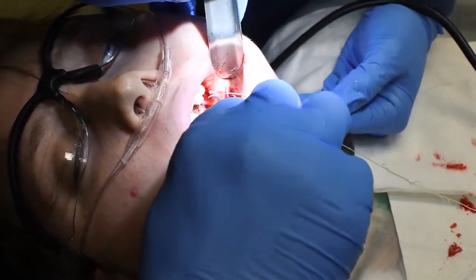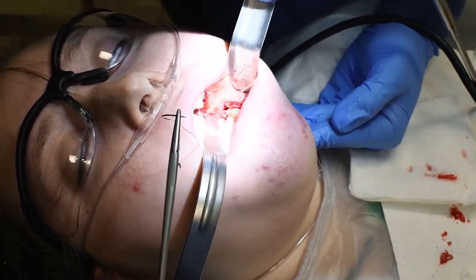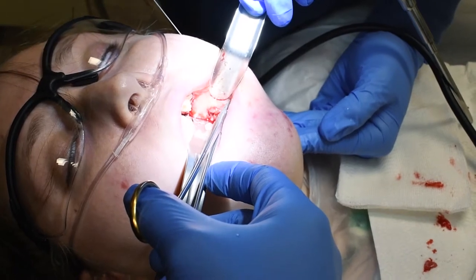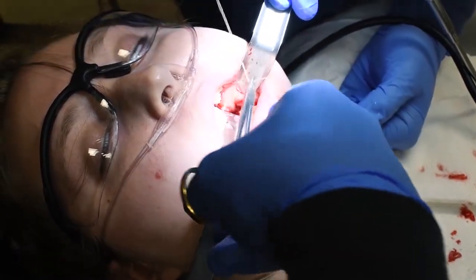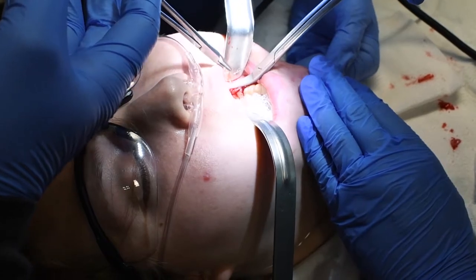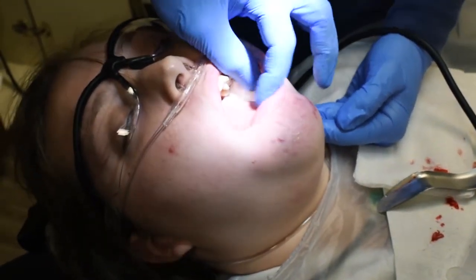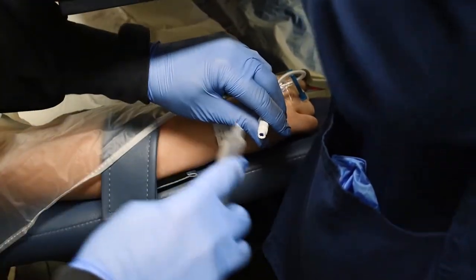This is what we call 3-0 plain gut suture. How are you doing on the vitals front? Now we're switching things out and packing this side off. I'm going to go to the other side — she's starting to get a little light with her anesthesia, so I'm going to give her a little more medicine. This is just sterile saline to flush this in, so all my propofol is now in.